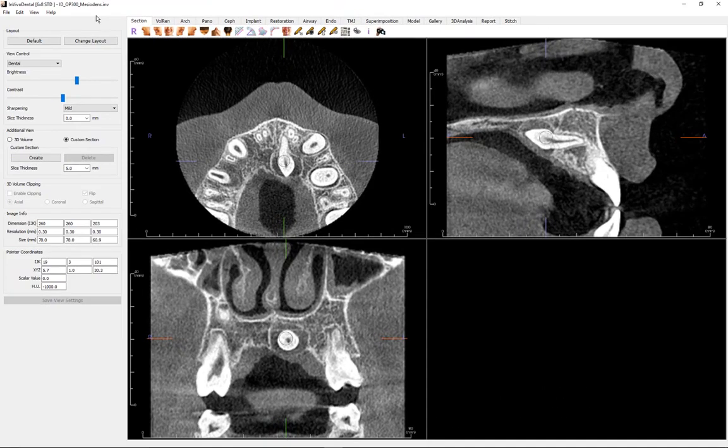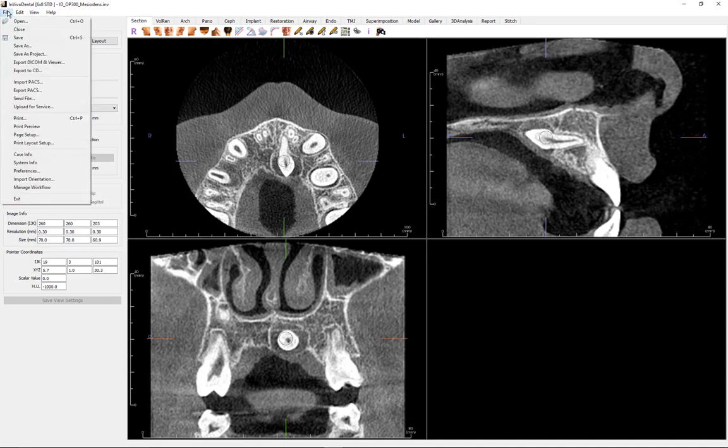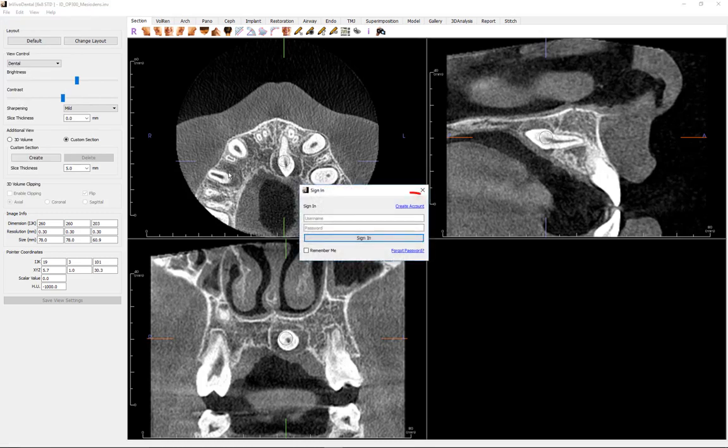To send a case through Anatomage cloud, the software prompts the user to sign in to an Anatomage cloud account. If no account was previously made, click Create Account to get started.